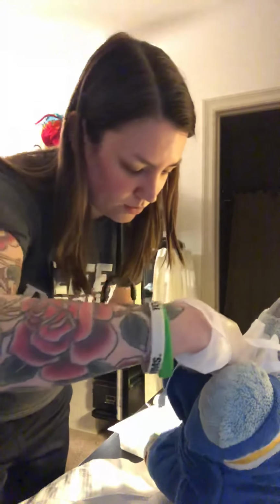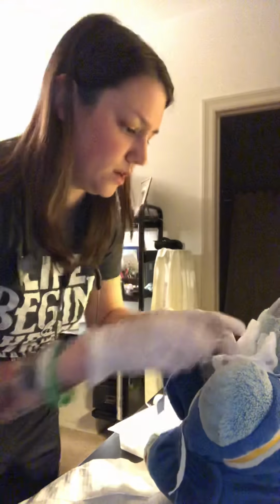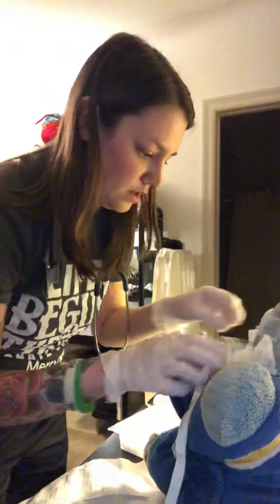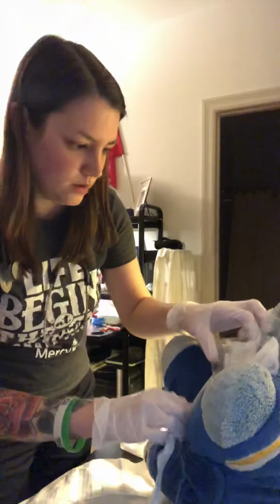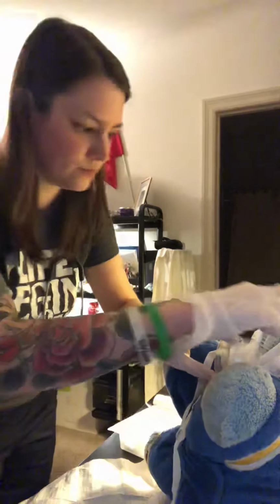Really working with my hole there. There we go. Put that through there. Make sure that still stays there. Okay, got the new collar on there for you. Make sure it's nice and secure there.